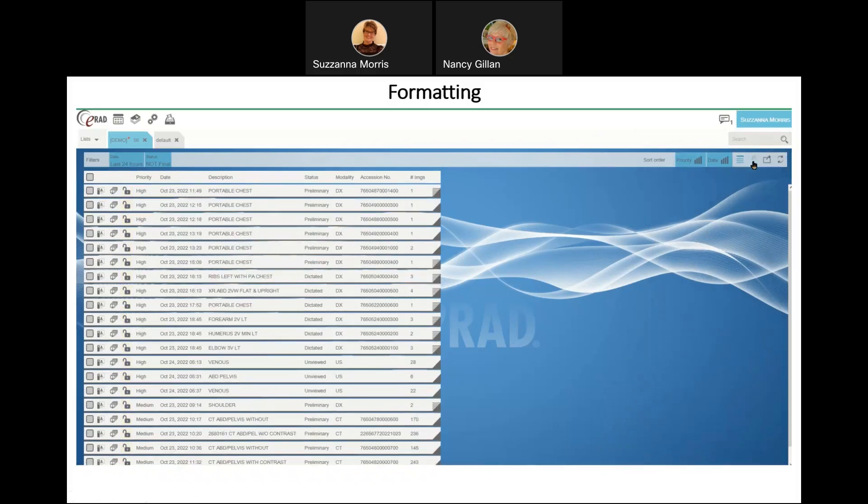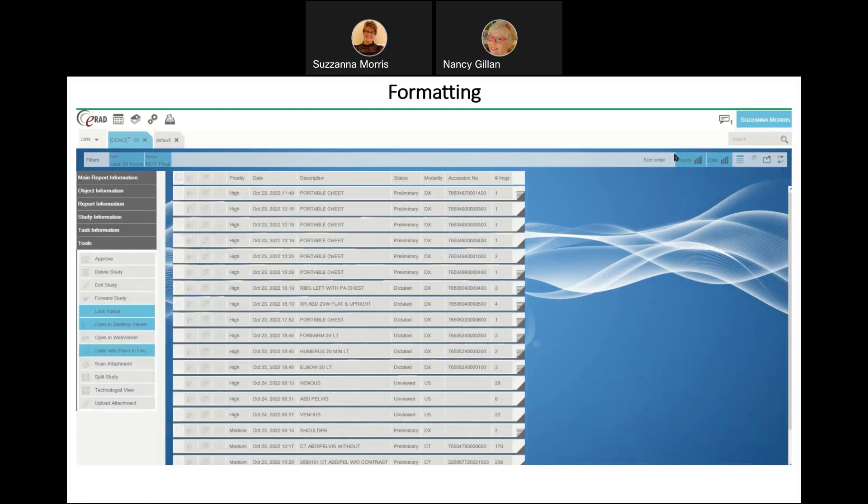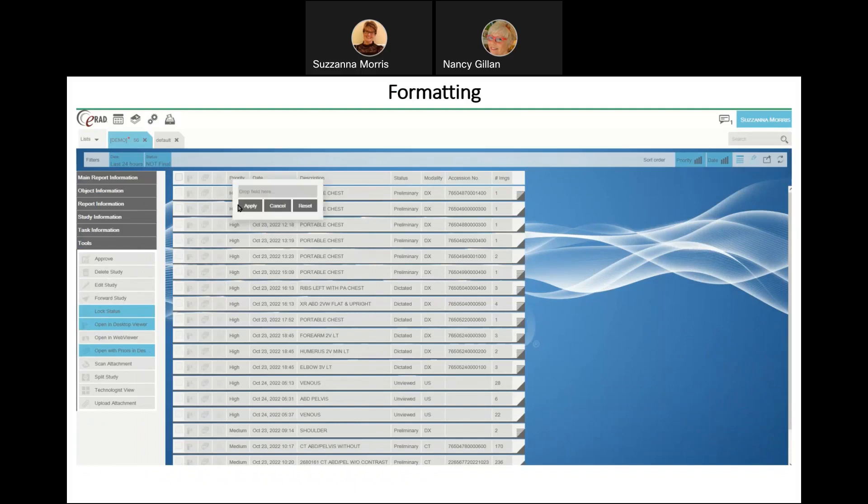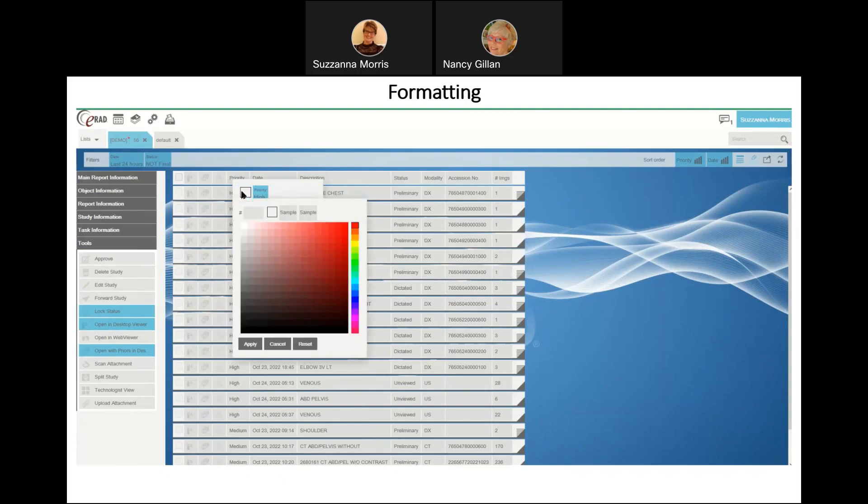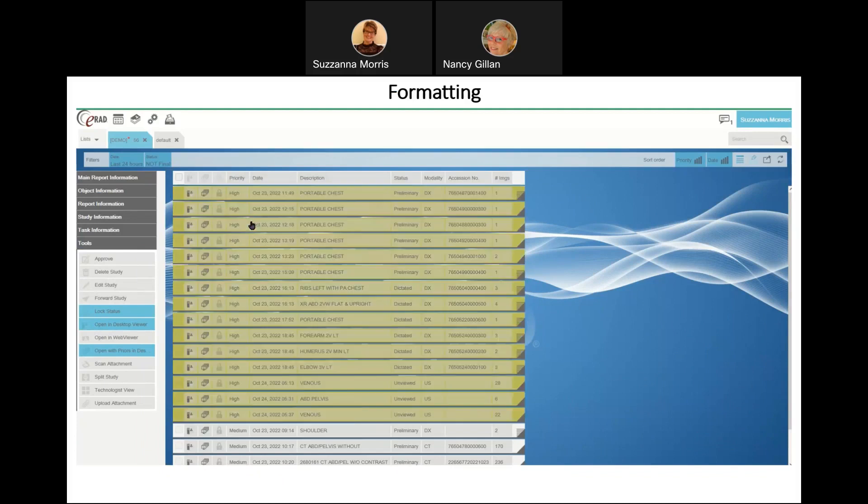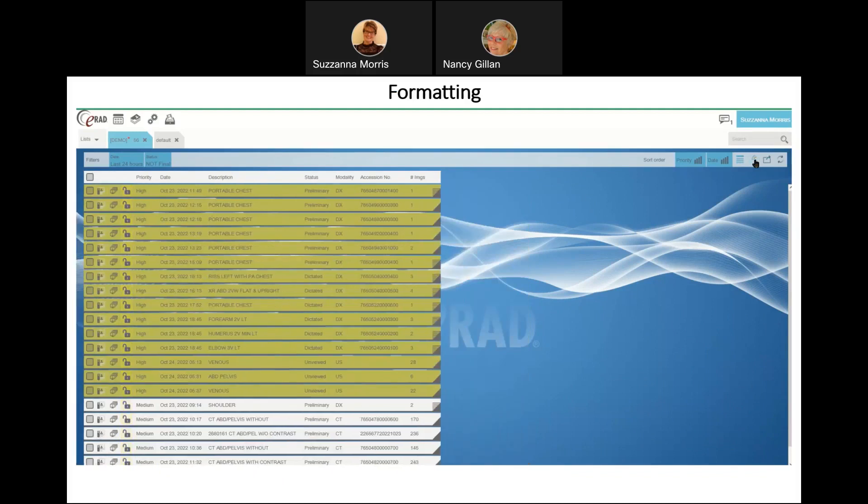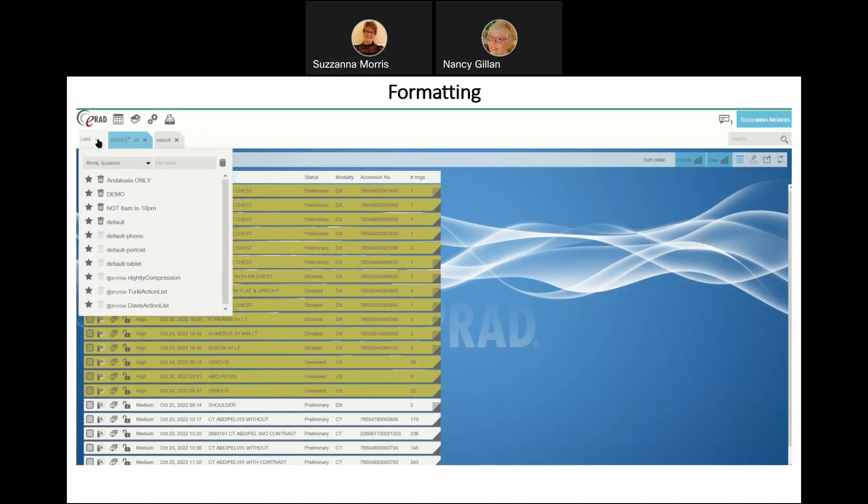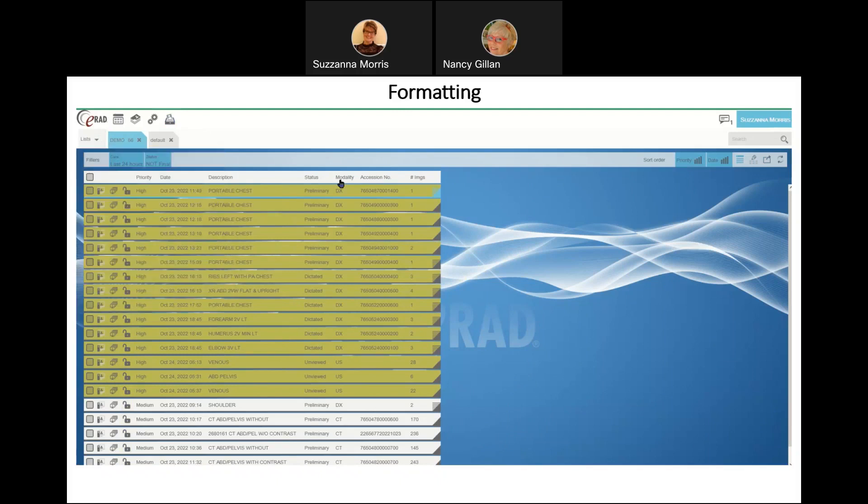Formatting your list is important and helpful for when you want to see things pretty clearly, easily up front. This is your layout editor, and this must be open if you're going to do any form of conditional formatting. We're going to do conditional row color on a high priority. We want those to stand out a little bit more. I selected conditional formatting, pulled in my high priority. I'm now going to select the color that I'd like for those rows to be. I chose yellow and hit apply. Then you'll come over and close your editor. Now your list is conditionally formatted to show you all of the high priorities in yellow. And as always, do not forget to save your list after you make your changes, or else you'll have to do it all over again.